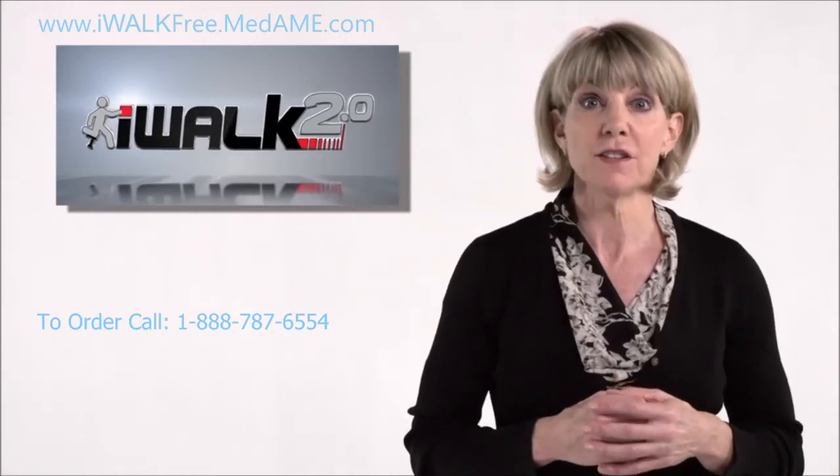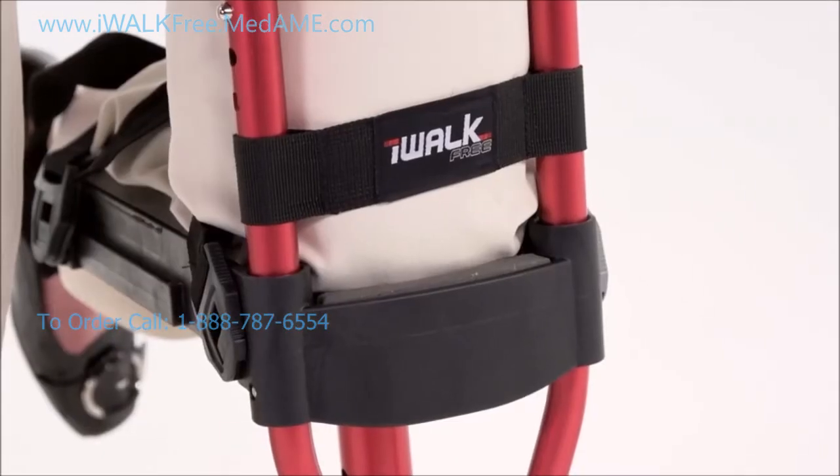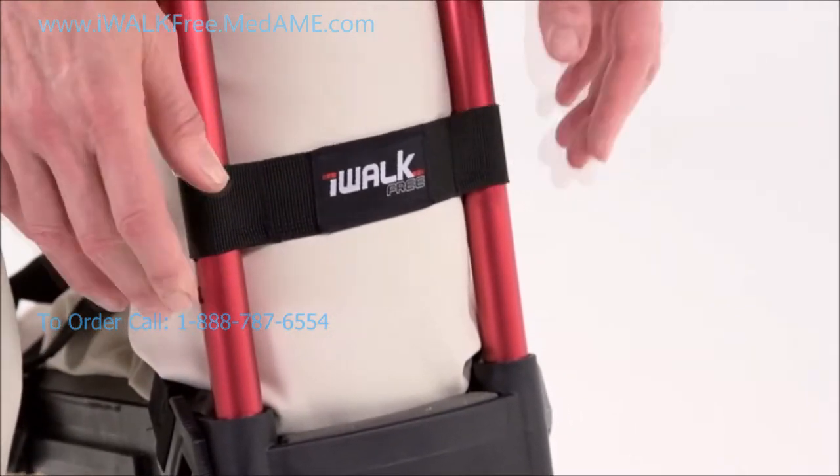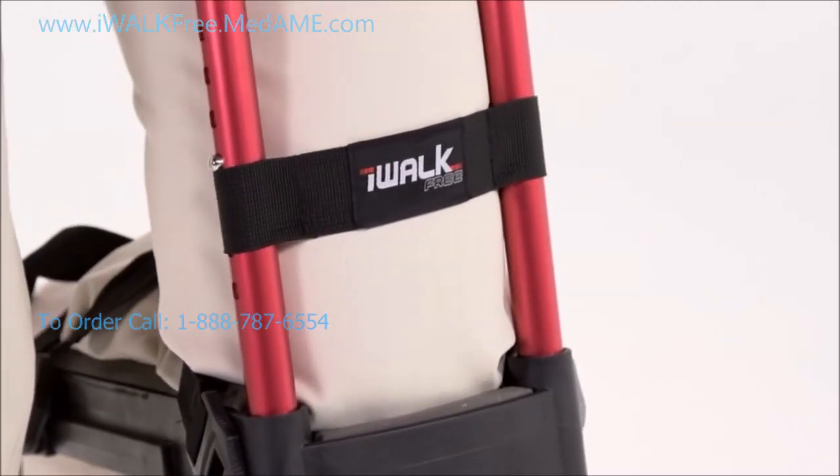At the front of the crutch there's a knee strap. This strap should be tied against your leg. Sliding it up or down controls the forward position of your leg, so experiment to find the setting that you like the best.